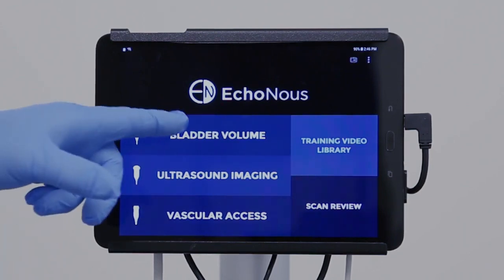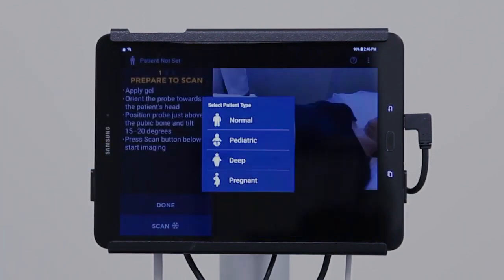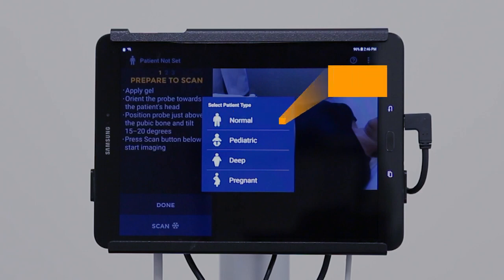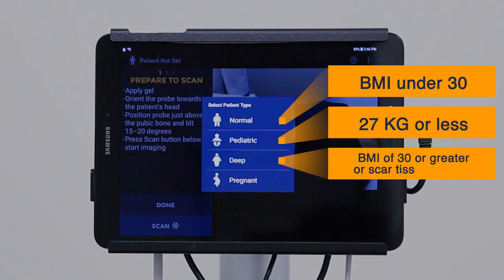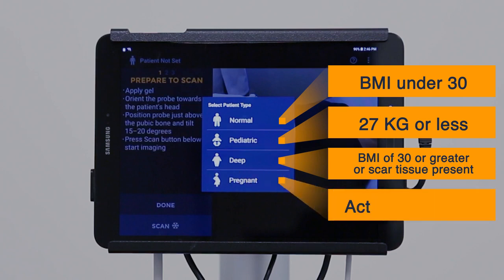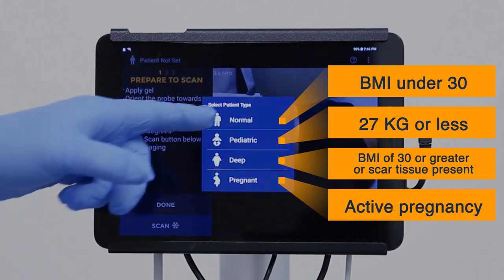Select Bladder Volume, then select the appropriate patient type. Normal should be used for patients with a BMI under 30. Pediatric for pediatric patients 27 kg or less. Deep for patients with a BMI of 30 or greater, or if scar tissue is present. Pregnant for active pregnancy. For this scan, we will select Normal.